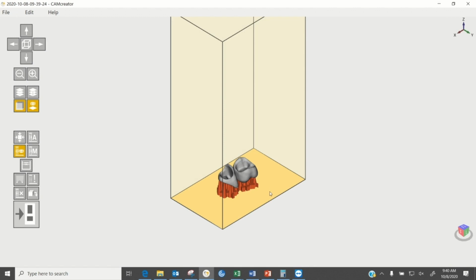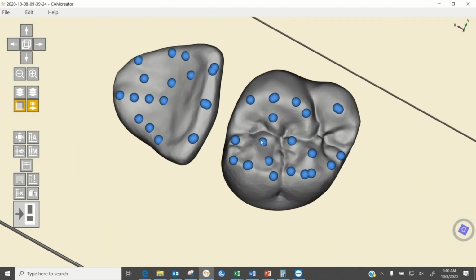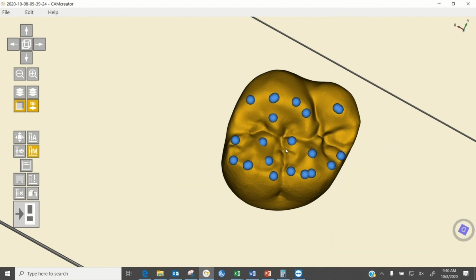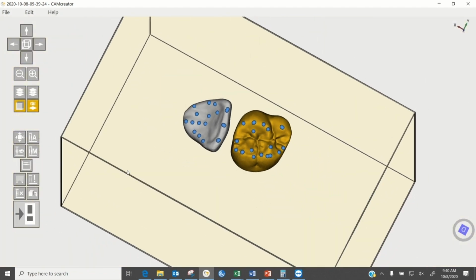Next, you can click a button to generate the supports. So all those were automated. And if you happen to review them and you see some that you don't like, you can go in and remove them. And this is a good strategy to do. You may find some that end up down in some anatomy that will make it a little tough to finish. So once you get the ones that will facilitate the finishing removed, you're pretty much good to send this to the printer.